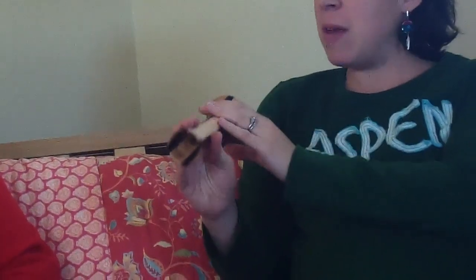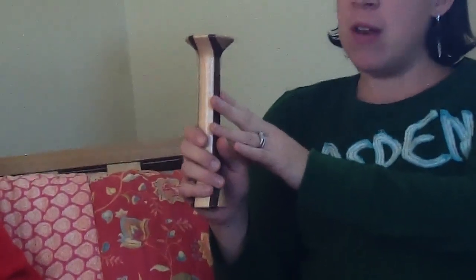This handy little tool is handmade. Got it a couple of years ago. And honestly, I don't use it too much. I think it was made by Amish out of some very beautiful wood. And the concept is the same, just that the one side goes on the belly, the other side on the ear, and it's just magnifying anything you would hear in the uterus. So some people really like this one. You obviously can't listen to yourself. That's a huge drawback. But kind of a cool tool to have around and, I don't know, listen to your friends' babies. Sure. But people like it because you can feel the sound. And I know when I've used it, that seems to be true. It's just a different quality of sound.